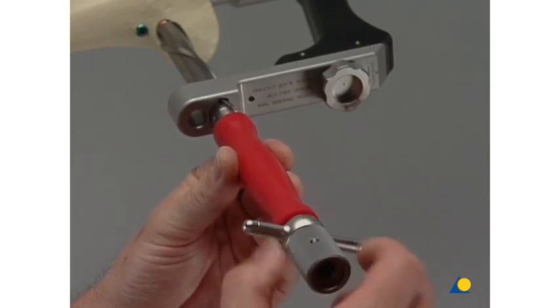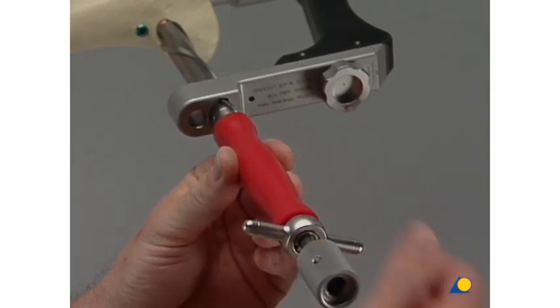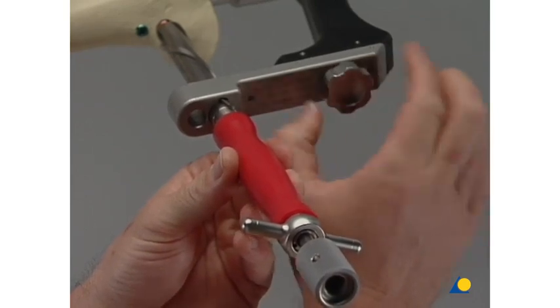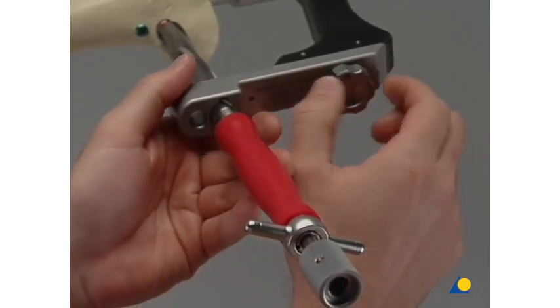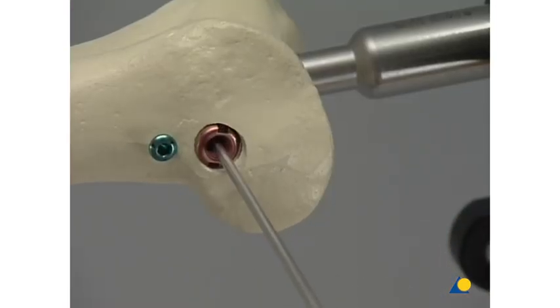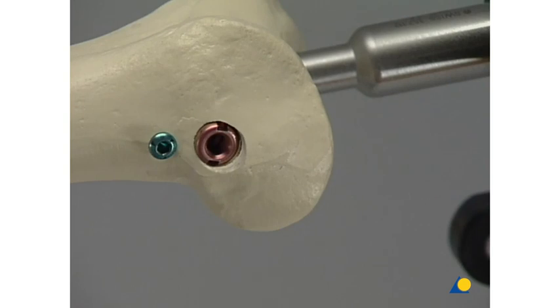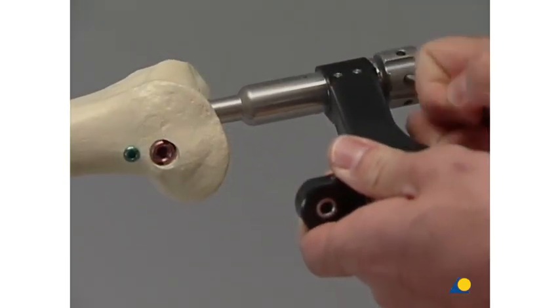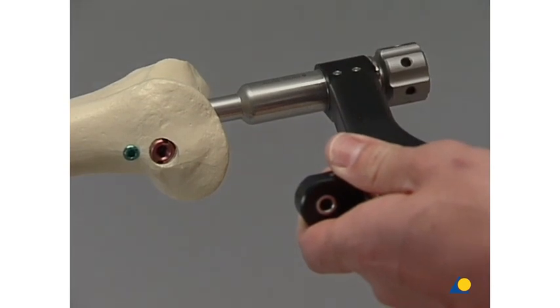The connecting screws for the spiral blade and the aiming arm are loosened and the inserter and the aiming arm are removed, as is the guide wire. Then the proximal locking follows, although it's not shown in this practical exercise. The connecting screw between the aiming arm and the nail is loosened and removed together with the insertion handle.